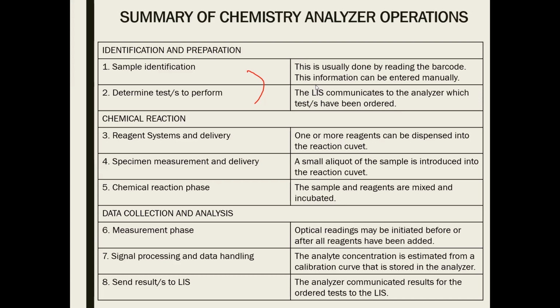Nandun na sa barcode na yon. That's why before you put the barcode in the test tube or in the cuvette, make sure that that barcode is intended for that sample. Kasi kung nagkabaliktad ka ng barcode, no, yung barcode A dapat ay kay barcode B mo napunta, ay di yung test ng barcode A magagawa kay sample B. Mali na po yun. Okay? Determine the test to be performed. The LIS communicates to the analyzer which tests have been ordered based doon sa ating barcode.